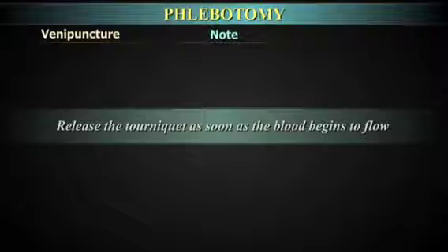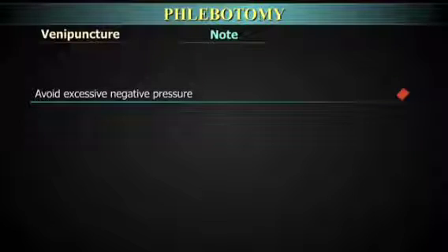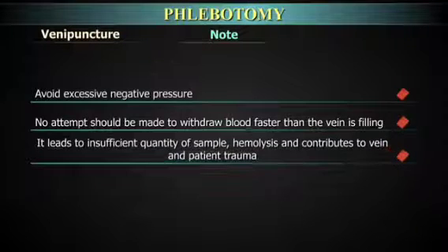Release the tourniquet as soon as blood begins to flow. Avoid excessive negative pressure. No attempt should be made to withdraw blood faster than the vein is filling. This will lead to insufficient quantity of sample, hemolysis, and contributes to vein and patient trauma.